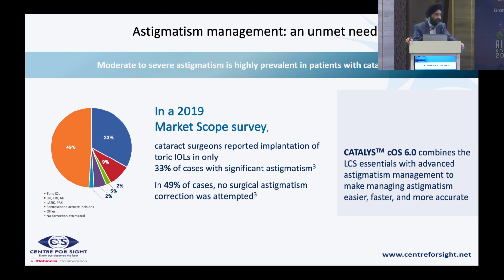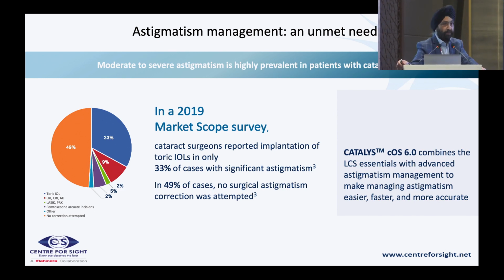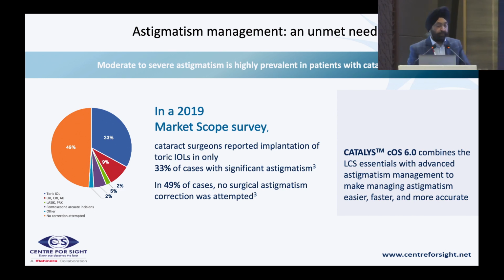So for clear vision, as has been impressed by my previous speakers, astigmatism management is something that is gaining ground significantly. This is a Market Scope study of the year 2019, which says that only 33% of patients with significant astigmatism are getting their astigmatism corrected, and 49% did not even have anything done, and the rest are the LRI, the LASIK, etc., and the femtosecond laser that is being done.